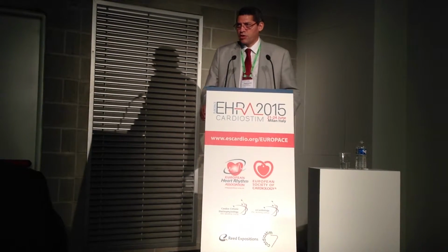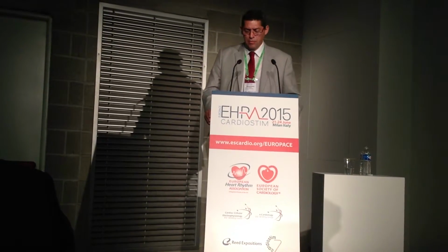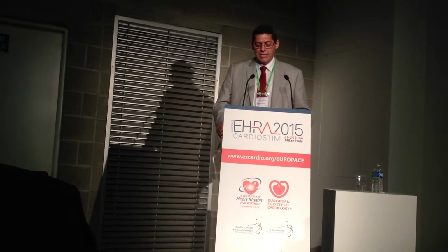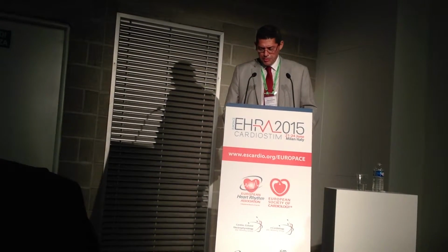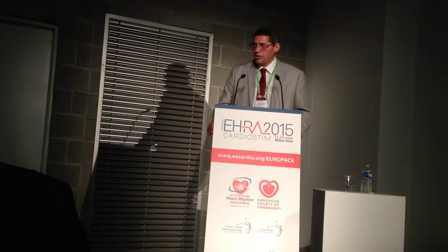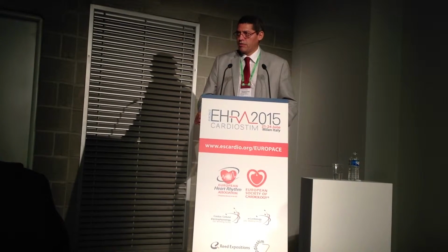Now, I am going to talk about catheter ablation. Why is it a challenge, and how can results be improved? In our experience, there are some rules to approach these patients. The first is the clinical knowledge of the patient, the symptoms, the type of arrhythmia, the complementary methods of diagnosis to evaluate the anatomy of the patient, and the possibility of arrhythmia-induced ventricular dysfunction.